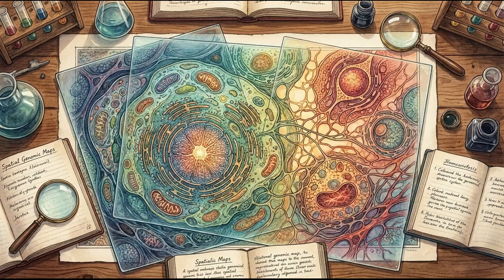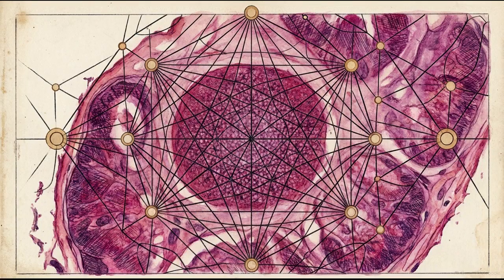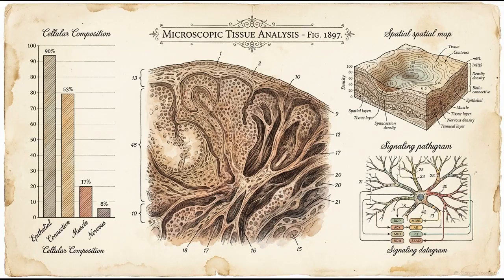These researchers then developed a pipeline to translate this complex spatial data into a scoring system that an AI classifier can apply to standard pathology slides. Shifting to a quantitative multidimensional model captures the prognostic information within the immune microenvironment that a binary label misses.